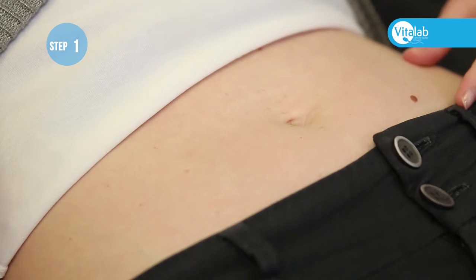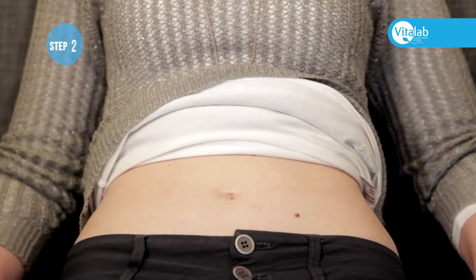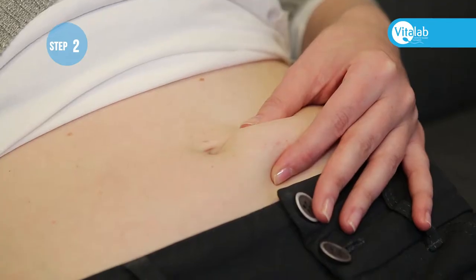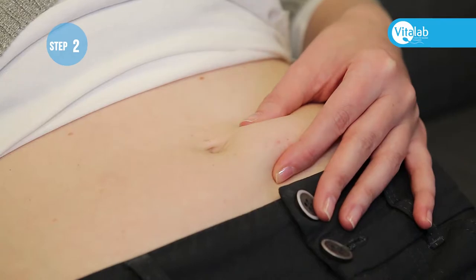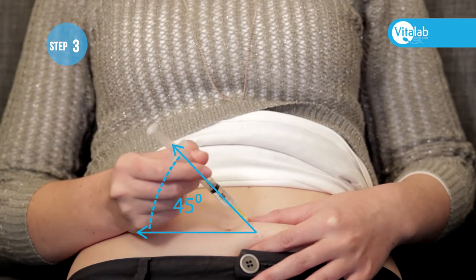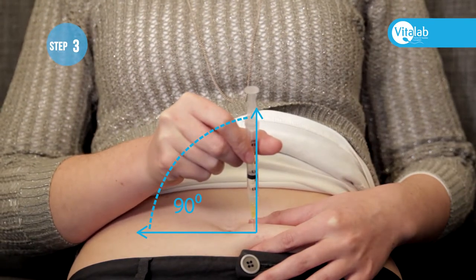In this area below the belly button, support the flesh between your thumb and finger. Do not squeeze too hard. Push the needle into the abdomen at a 45 to 90 degree angle.